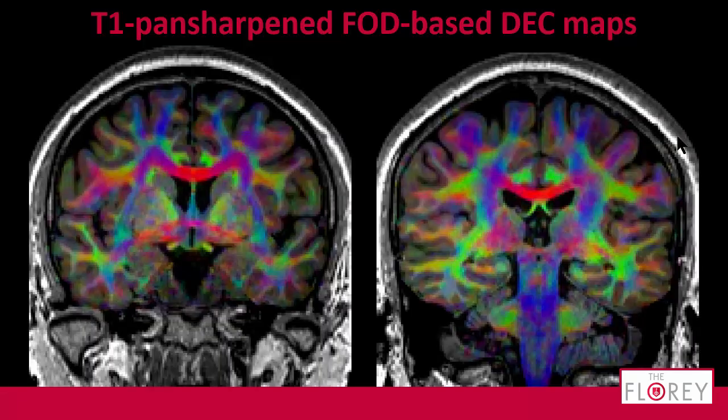These are some results. So I'll just let you look and interpret for yourself. This is at the level of the anterior commissure there. You can even see it. This is at the level of the posterior commissure. That's a bit pushing it, of course. Certain things that you can see is a nice delineation of the ventricles because of the T1.